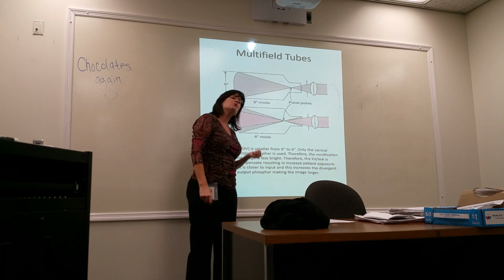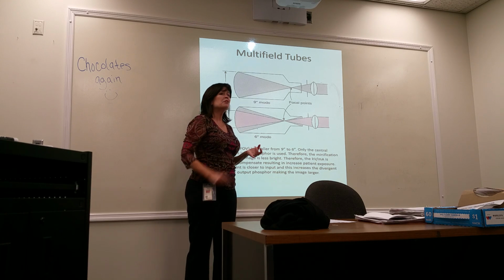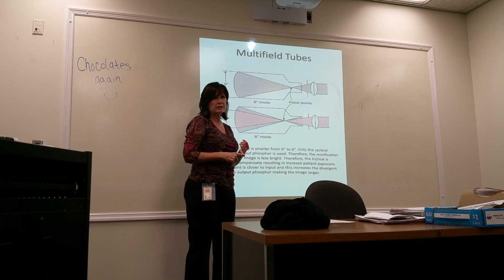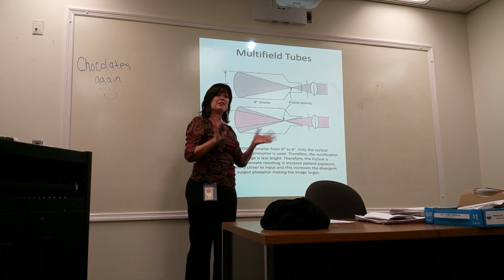So my question to you will be, what happens during the magnification mode? You would say the focal point is closer to what? Input phosphor, and further away from the output phosphor. So watch the reference point.